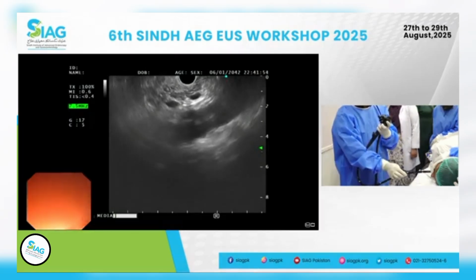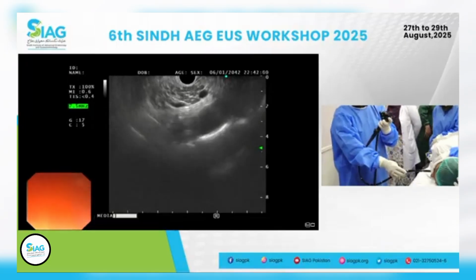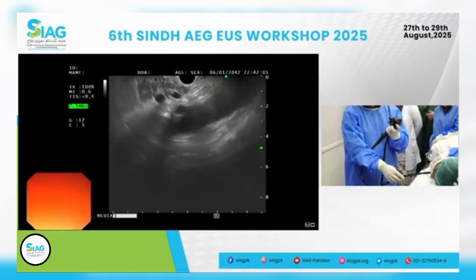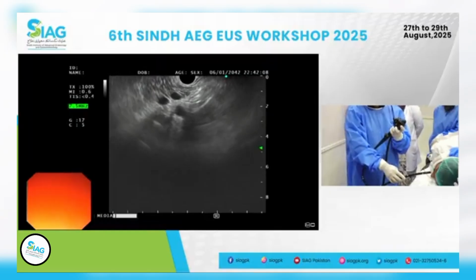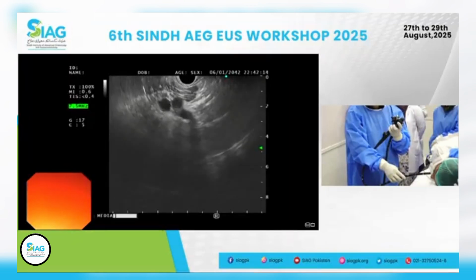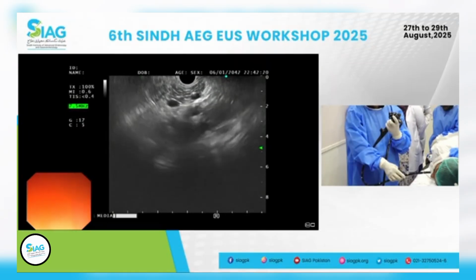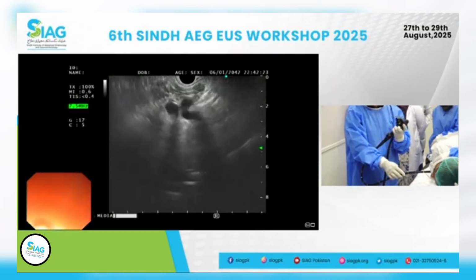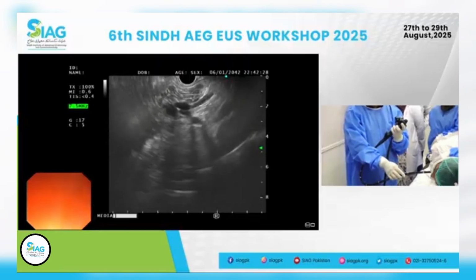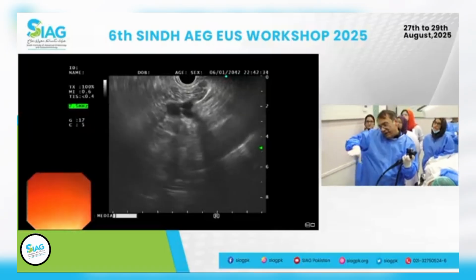I already see the pancreas right above that, but I'm going to show you what to do with the celiac. Once you're at the celiac, my goal is to keep that at 6 o'clock position. So I will keep that at 6 o'clock position, gently advance the scope. I'm just going to follow that celiac, and you see the left gastric coming off that. That's a celiac right there. Right here, there's a small vessel coming off, left gastric. Then it's going to divide into two, and splenic already has taken me honestly to the pancreas, so I'll take that. But the common hepatic is going downwards to the liver because the liver is right here right now.